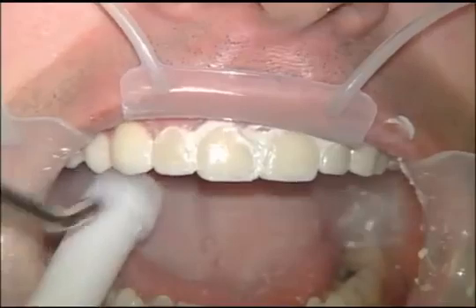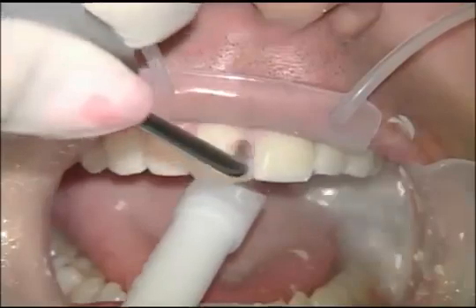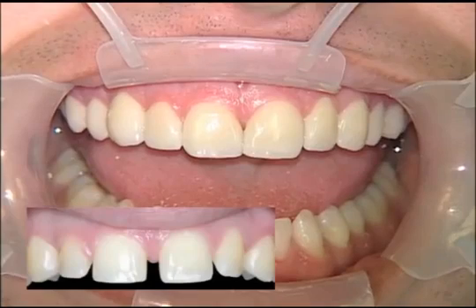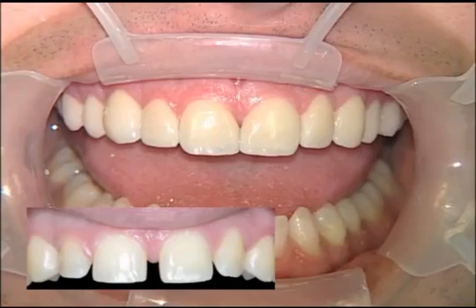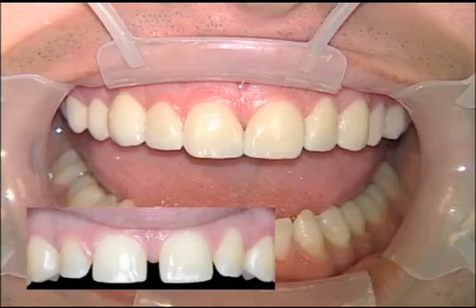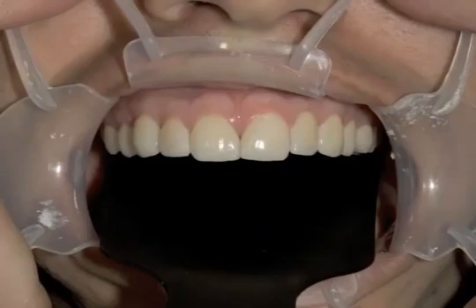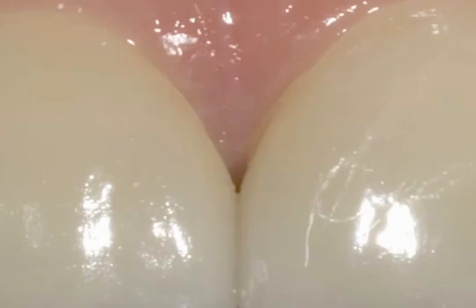When we're done polishing, we're going to go ahead and rinse off the rest of the polish from the veneers and take a look and see how they look and see if we've got anything that needs to be touched up. You can see on the before picture the big spaces that were present before. And this is one of the great times to use a no-prep case when you've got somebody who needs a little additional tooth length, has some large diastemas in between their teeth, because you can accomplish both those goals at the same time. You notice we still have a small black triangle at the gingival margin between 8 and 9 in that gingival embrasure. And sometimes with a no-prep case, it's impossible to close a large diastema completely. In fact, that's a really good job that the technician did on this case.